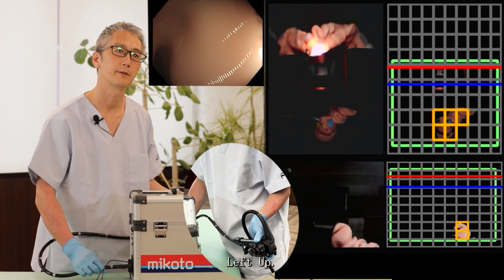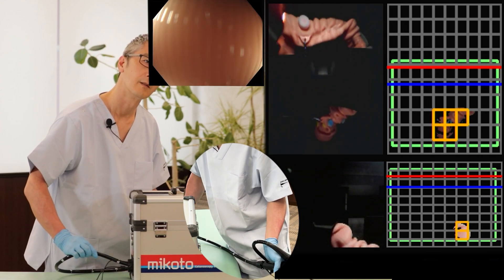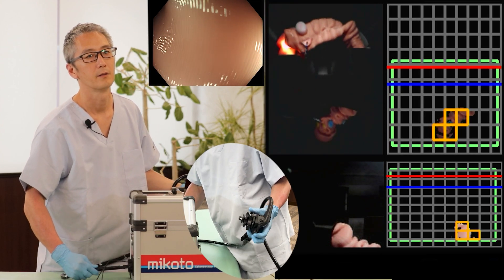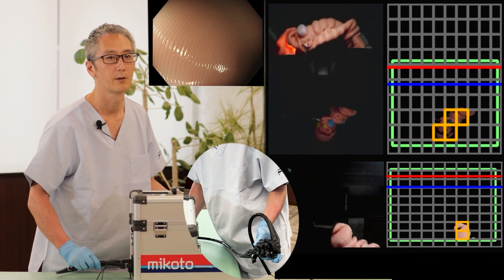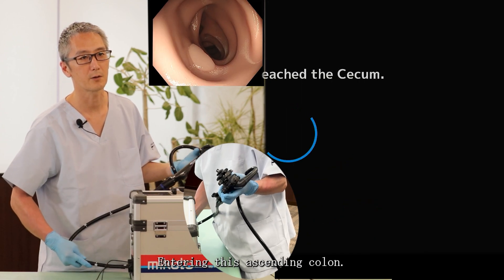Left up. Find the opening to the hepatic flexure, going to the right and entering the ascending colon.